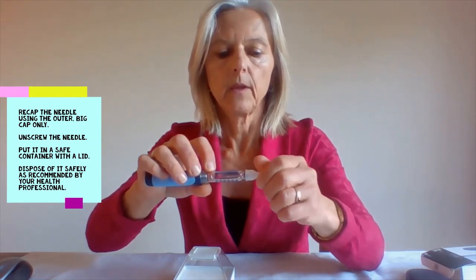You can now recap the needle with the outer cap. It's not recommended to use the smaller cap as it could cause injury to yourself. Unscrew the needle and put it in a safe container with a lid and dispose of it safely as recommended by your health professional.